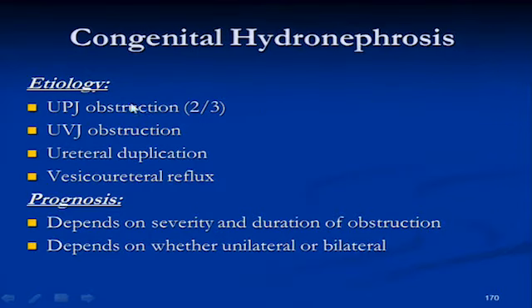If we see mild dilatation, pyelectasis, we bring the patient back in about 5 to 6 weeks. If it's still there, we bring her back one more time. But if at 5 or 6 weeks it looks normal, then we reassure her we don't need to rescan the baby. Everything is fine.